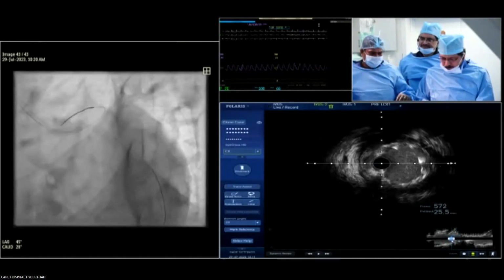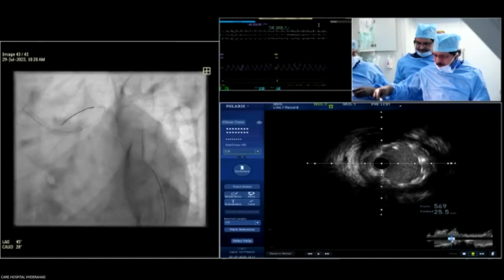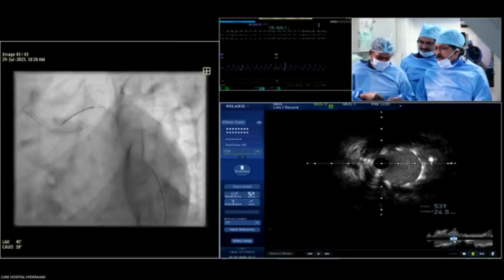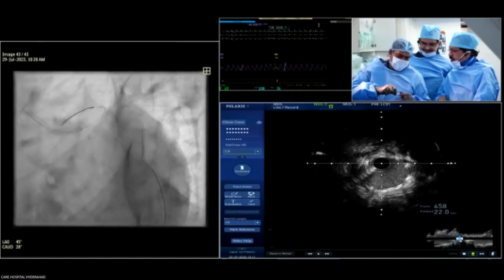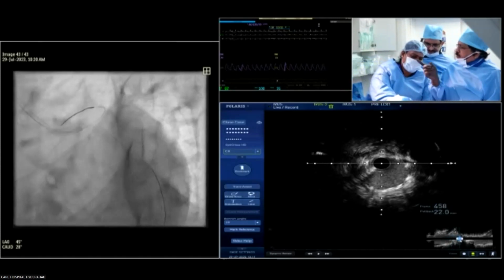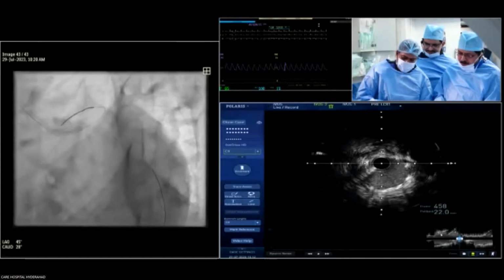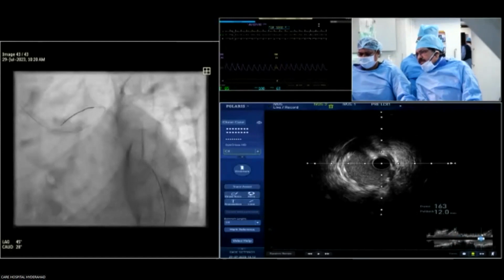It's actually really nice to see this case in contradistinction to the case yesterday that had an OCT. In this case you can actually see the struts come back into the left main, whereas the other one yesterday just stopped at the carina. Yesterday we had said you don't need to dilate the ostium of the circ anymore because you're only coming briefly, but when you cross over, then you should make sure that it's well apposed because it's persistent, basically across.